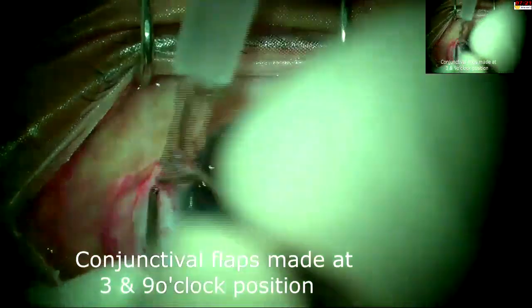First, the vertical diameter of the cornea is measured and the center is marked. Two conjunctival flaps are created at the 3 and 9 o'clock positions, after which any bleeding is cauterized using bipolar cautery.